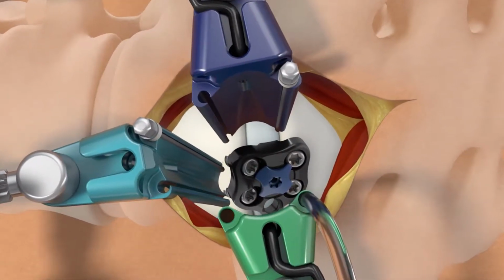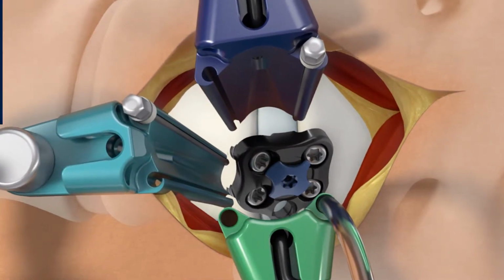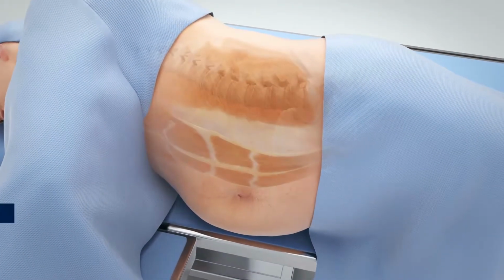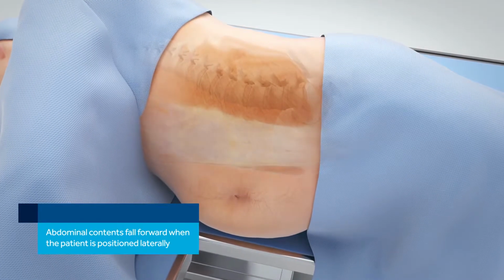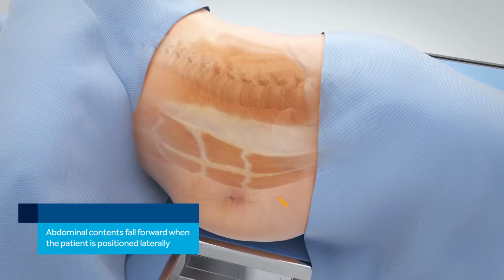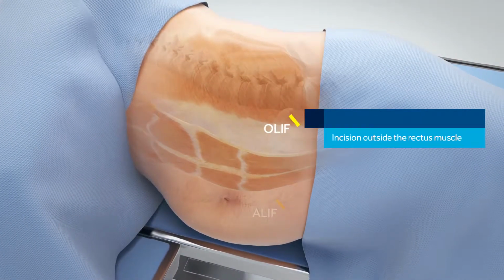The OLIF51 procedure is an oblique lateral approach to the L5-S1 disc space. When the patient is positioned laterally, the abdominal contents fall forward, so less retraction is required to access the spine. Compared to a traditional ALIF, the patient benefits from an incision that is outside the rectus muscle.